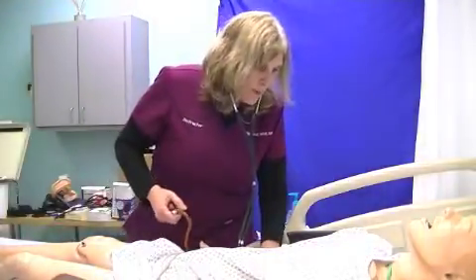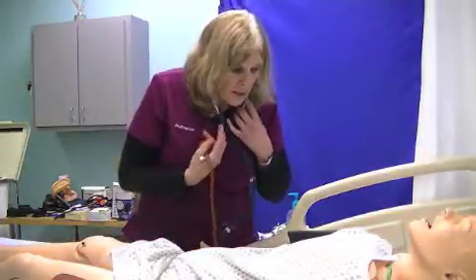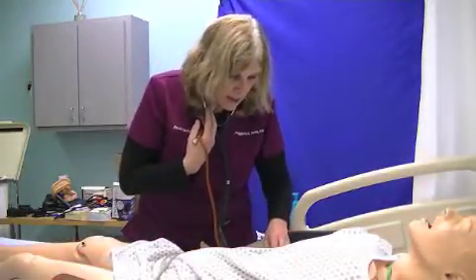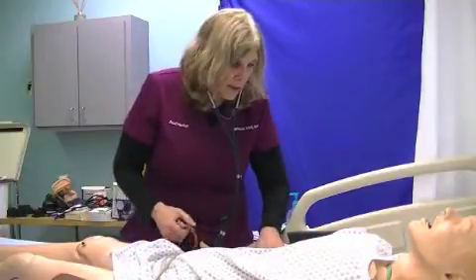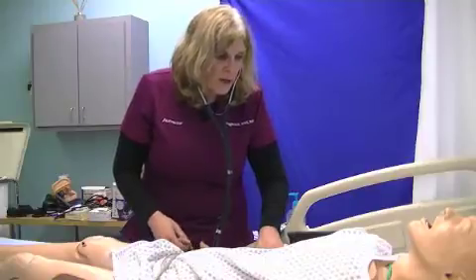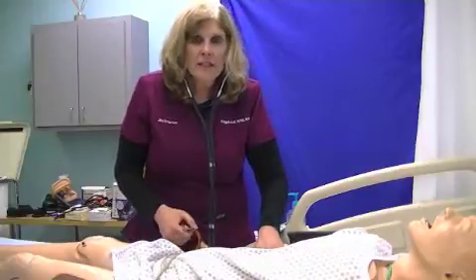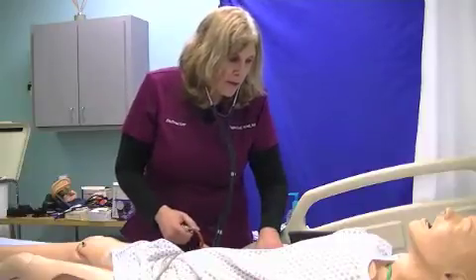We're going to pump this up. We're going to start out and pump up to 80. A lot of times what I do first is pump it up to 80, feeling my brachial pulse. This is the correct way to do it. I'm trying to palpate the systolic blood pressure. It's an estimated systolic blood pressure. So I'm going to pump it up to 80.